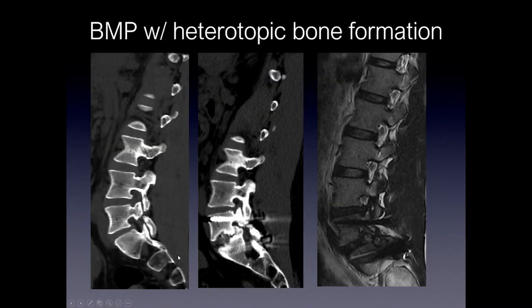Here's an example of bone morphogenetic protein placed with heterotopic bone formation. This patient had a pars interarticularis defect with a little bit of spondylolisthesis, ultimately went on to fusion, and some bone morphogenetic protein was placed in the spacer. You can actually see some heterotopic bone formation occurring here. This can cause symptoms because of significant narrowing — it can extend into the neural foramina and spinal canal. In this case, it caused significant foraminal stenosis and pressure on the nerve root, and this patient had to be reoperated on.